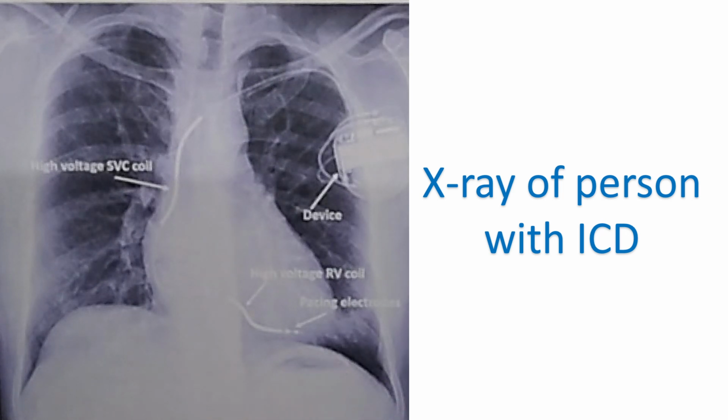That is meant for backup pacing. Whenever you give a shock or any other treatment for a tachyarrhythmia, you should expect bradyarrhythmia following that. There could be bradycardia after the shock, and that will be taken care of by these pacing leads. Backup pacing for bradycardia after a shock.